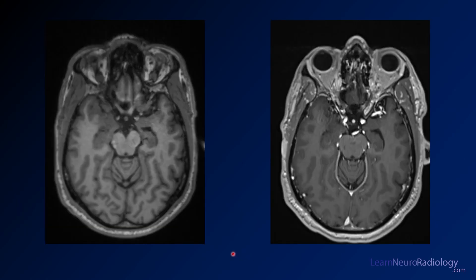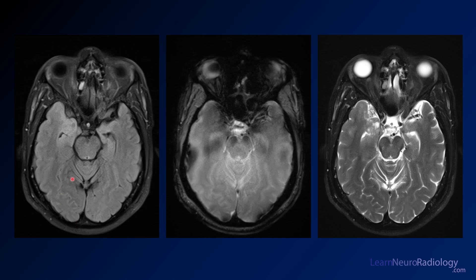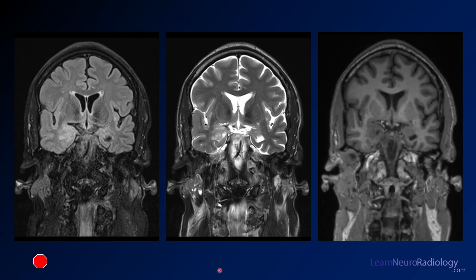Or maybe not. This is a pre-contrast T1 and post-contrast T1. We're looking at a little bit of a subtle abnormality here. I'm going to go back and give you a little bit of a clue — I want you to look at this right temporal lobe here. Maybe it's a little bit asymmetric.